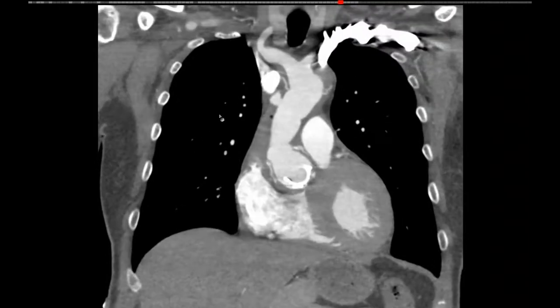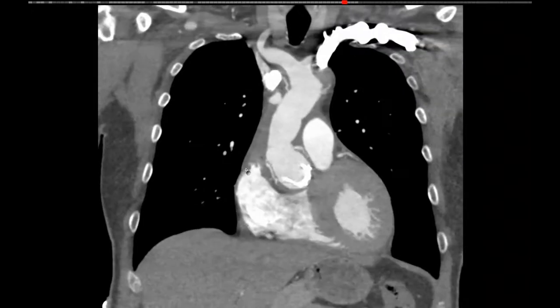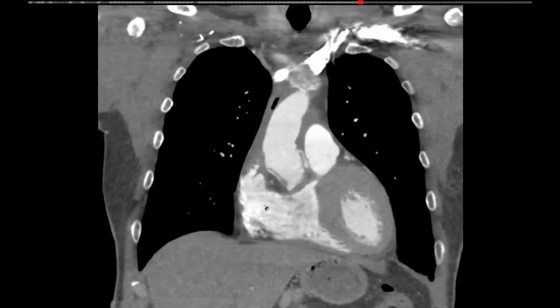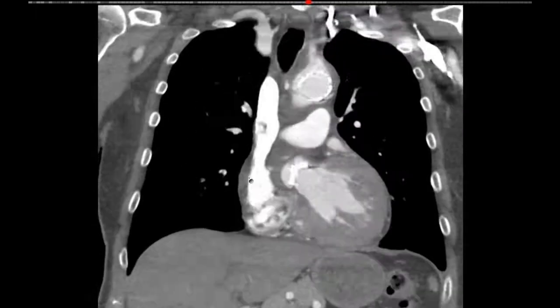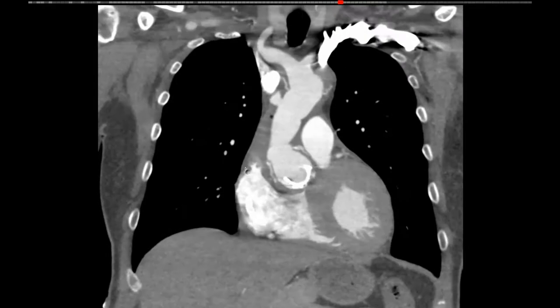Oh, but now I remember why I wanted to show this. So one thing that came up when we imaged the patient postoperatively before discharge was this. So that is a pseudo-pseudoaneurysm, and it is the location of a sewn off side branch of a HemaShield graft. So they put a HemaShield graft in the ascending aorta. So this is all HemaShield graft. And what they also did was they did a bunch of anastomoses for the brachiocephalic arteries. No, they didn't. Let me just see something. No, they didn't do that.